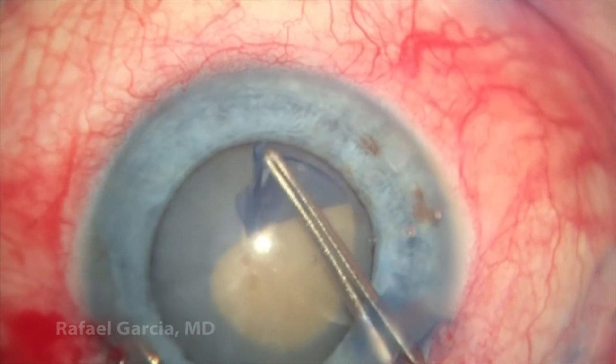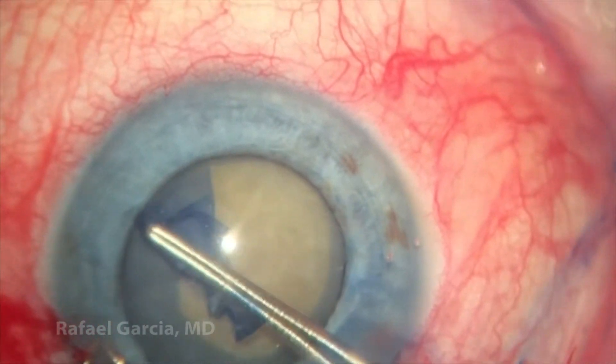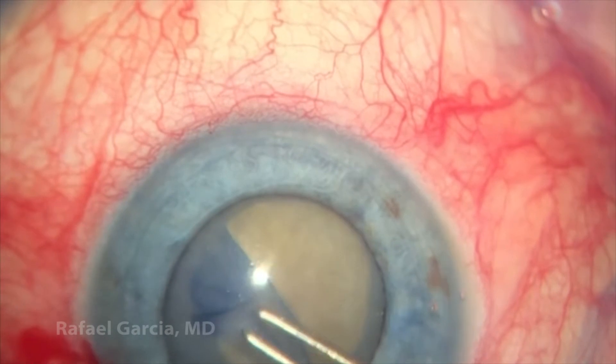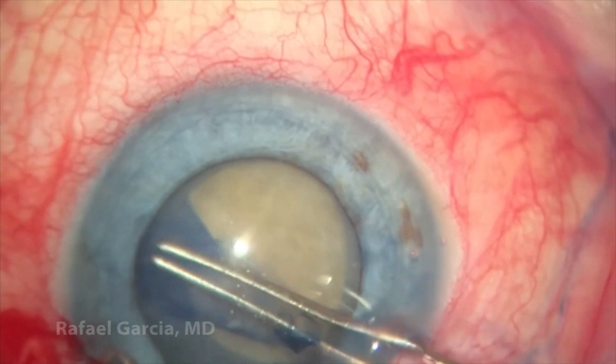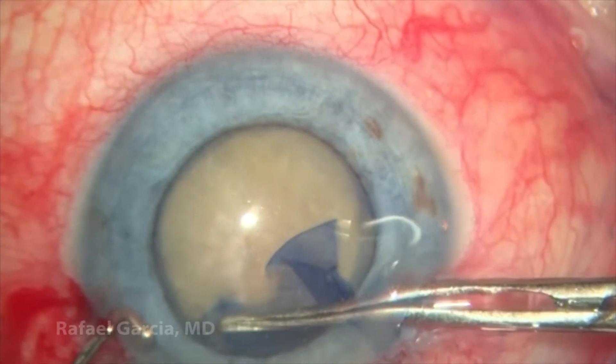Otherwise the surgery can become very challenging as the pupil comes down during the procedure and you may run into a lot of trouble. So nice and easy, slowly but surely, we end up with a good rhexis while the pupil still has a reasonable size.